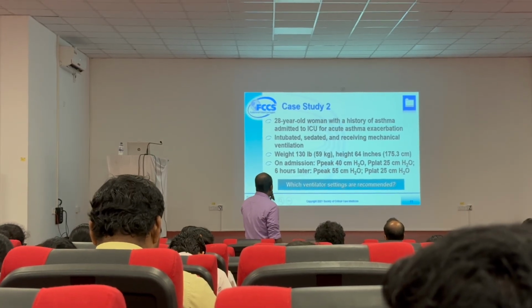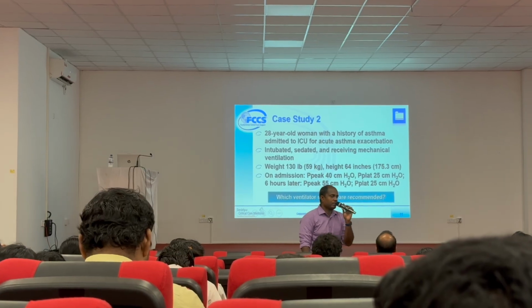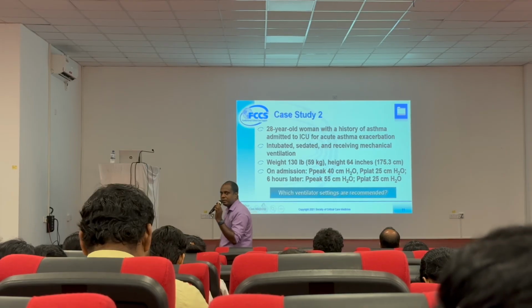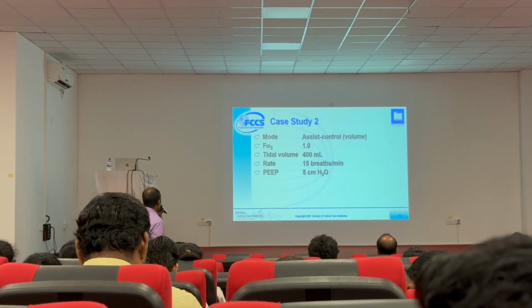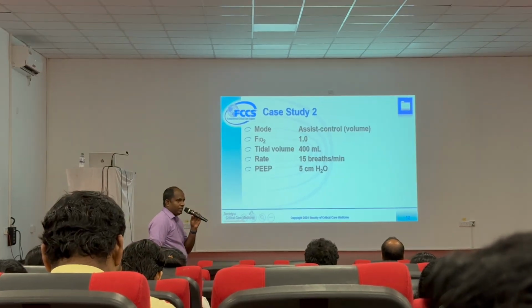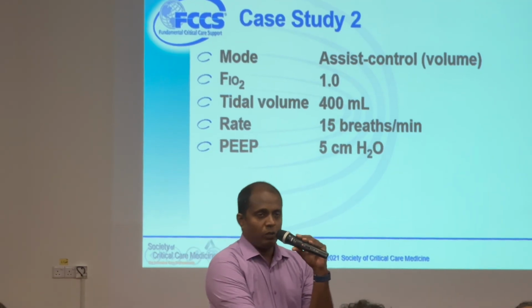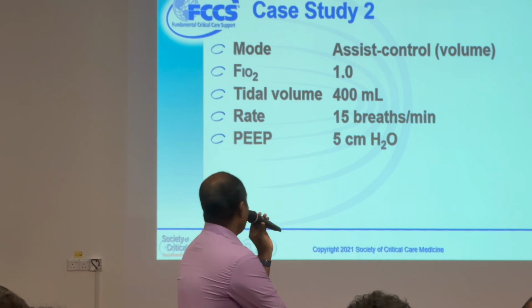Six hours later, the peak pressure goes up and the plateau pressure remains unchanged. What is the meaning of that? It's quite simple. The resistance is going up. So the initial mode of ventilation is always assist control. Modern prescription is always assist control. There is no prescription of SIMV or anything.